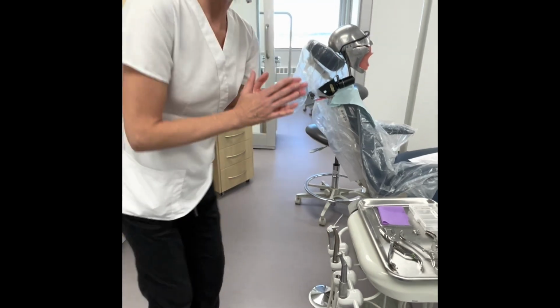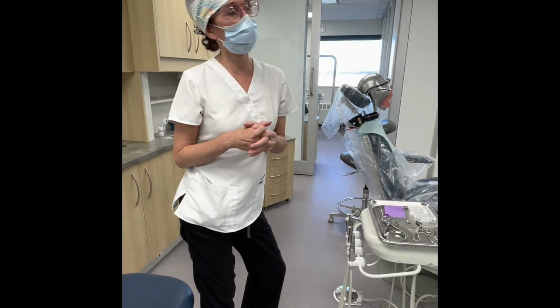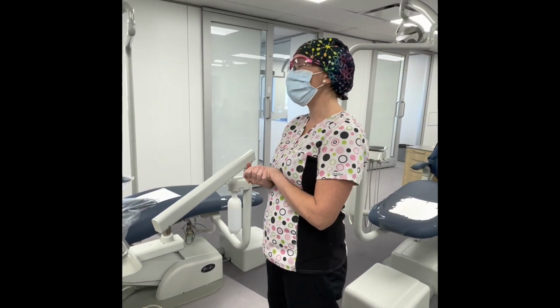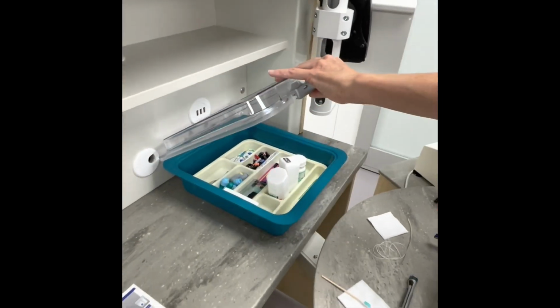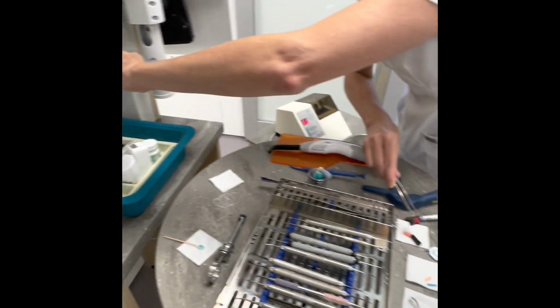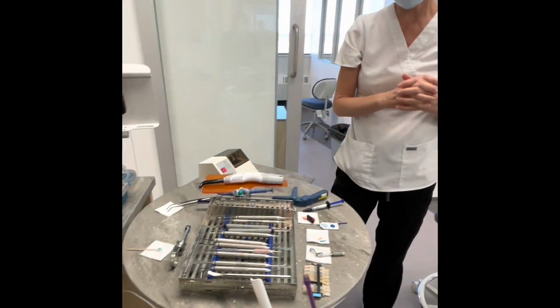Okay, so I have my burrs in my hand pieces. One other thing that I want to ask Amanda is, what color of composite cartridges should I put out? So for today's procedure, I will take an A2 cartridge, please. Okay. And that is what Stacy's going to do. Is she's gonna go into her tub here and retrieve with her marked pliers some of our composite. For the purposes of this course, there is just an assortment of cartridges in there, so you don't actually need to be specific for which one you are retrieving.